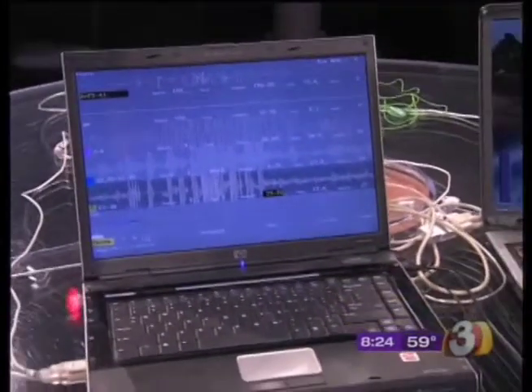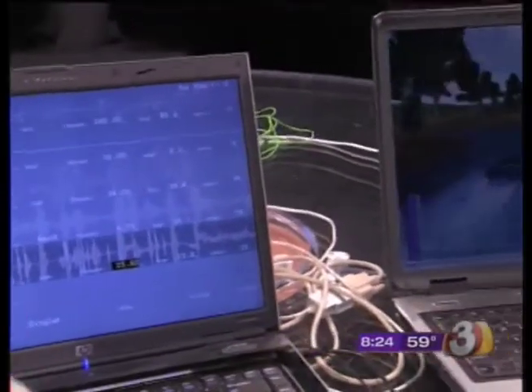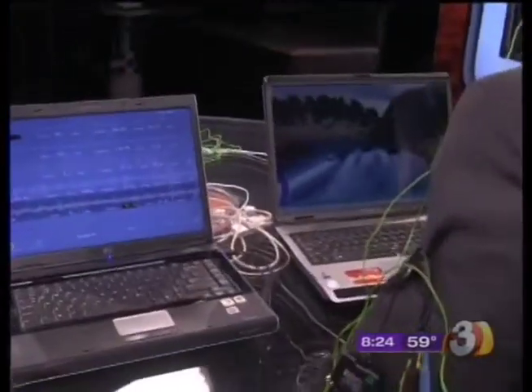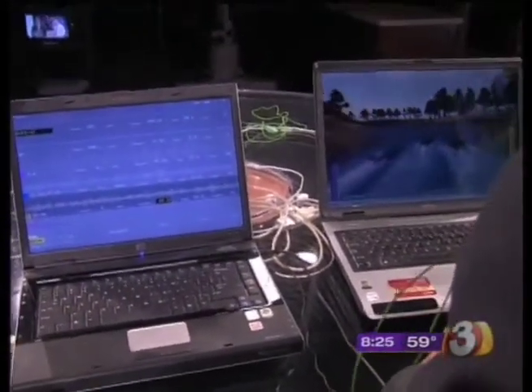So by looking at the charts over there with these brain waves, you're able to see what his brain waves are saying about his ability to focus? Yes, we can see him here. I can see when he's focusing, when he's drifting. And then as I teach the person how to read their waves, they can control them, and it starts to click, and they're learning just like learning an instrument or riding a bike. Their brain retains it, and it learns to get into that state much more readily. That is really fantastic and fascinating. So then you're able to diagnose exactly what's going on with the ADHD and maybe give some sort of treatment. Exactly, right. As an adjunct or supplement to medication, or in many cases, you can avoid medication.